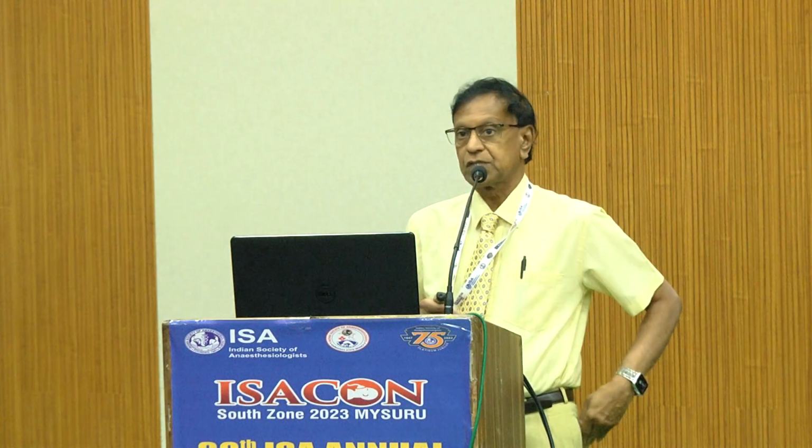Now, this is the classic standard terminology of capnography. We formulated this terminology in the mid-90s, and it is also used in Nunn's textbook of physiology and Miller's textbook of anesthesia. It is usually divided into phase 0, phase 1, phase 2, and phase 3. Phase 1 is from the dead space, phase 2 is a mixing of the alveolar gases with the dead space, and phase 3 reflects the alveolar gases. And then you take the next breath.